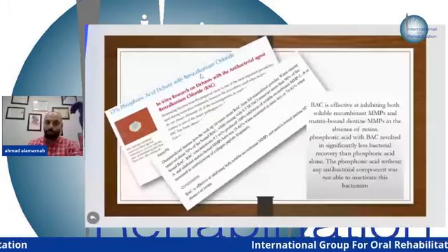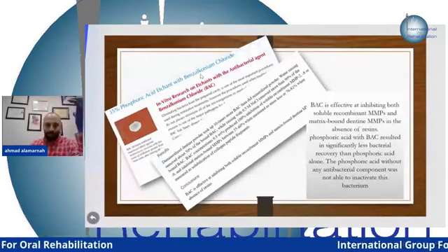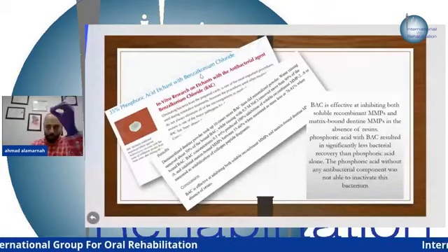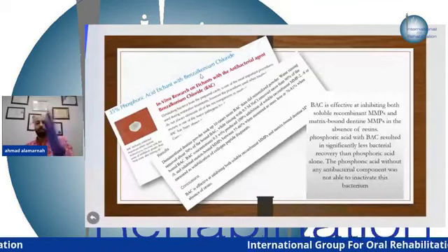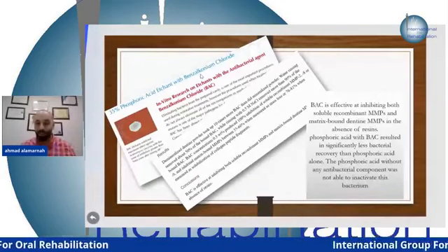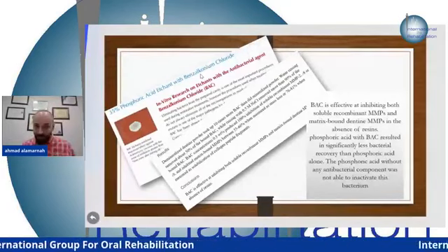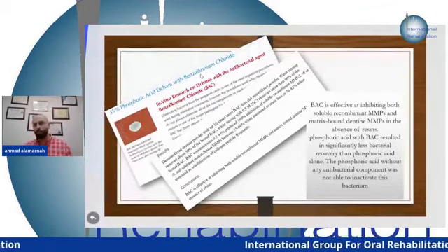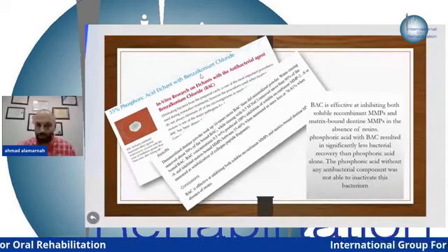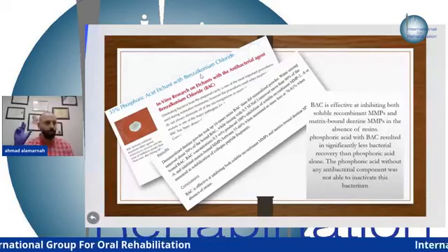The second thing, you can use an acid etch that contains benzalkonium chloride. It's an antibacterial component that some companies added to the acid etching gel. It's very strong. The literature says it's twice or triple the effect of the chlorhexidine and sodium hypochlorite for preventing the production of matrix metalloproteinase enzyme. But it's very expensive. The tube of the acid etching costs like $20. The normal one will cost like $7, something like this. In shekels, 3 tubes of Spident acid etching, 45 shekels.